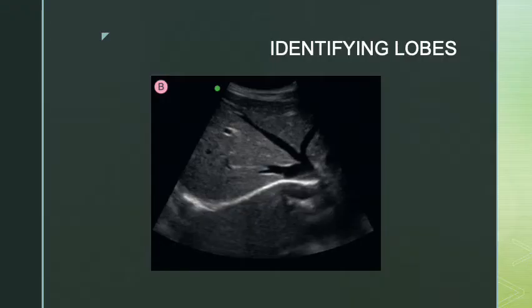Now we're going to go through some images and practice identifying our lobes. The more you do it, the better you'll get. This is a transverse image of the liver at the superior portion. I know that because I have my hepatic veins draining into my inferior vena cava.